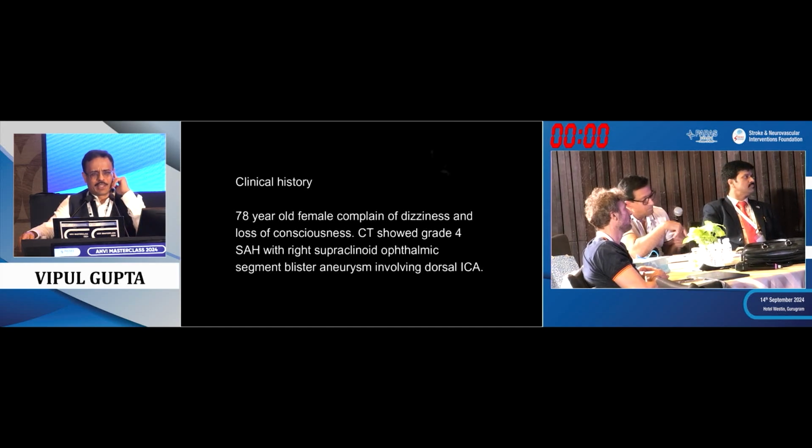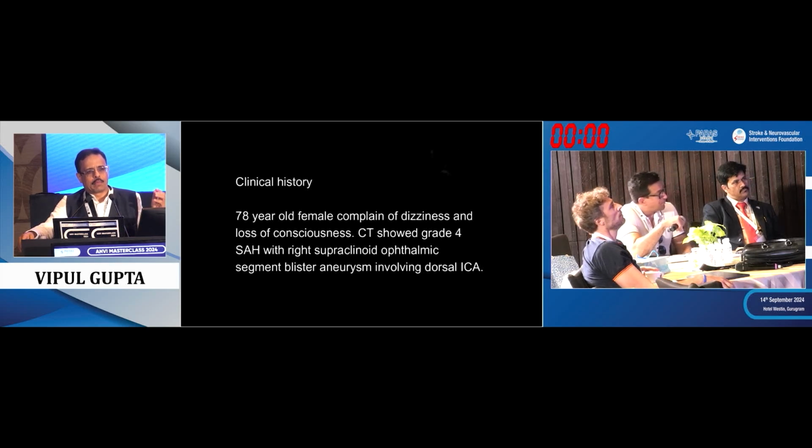Okay, so I used to do stent-assisted coiling, and we've done quite a few of them, but you know, trapping a microcatheter in the small ones, placing a coil. Of course.